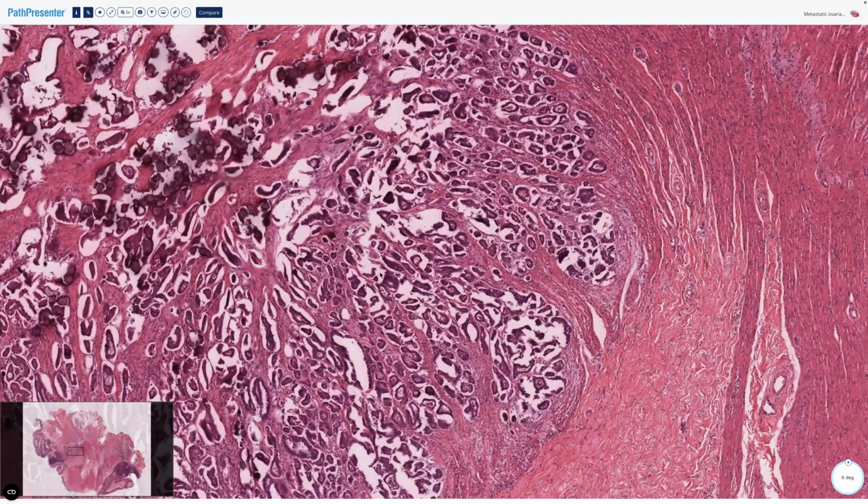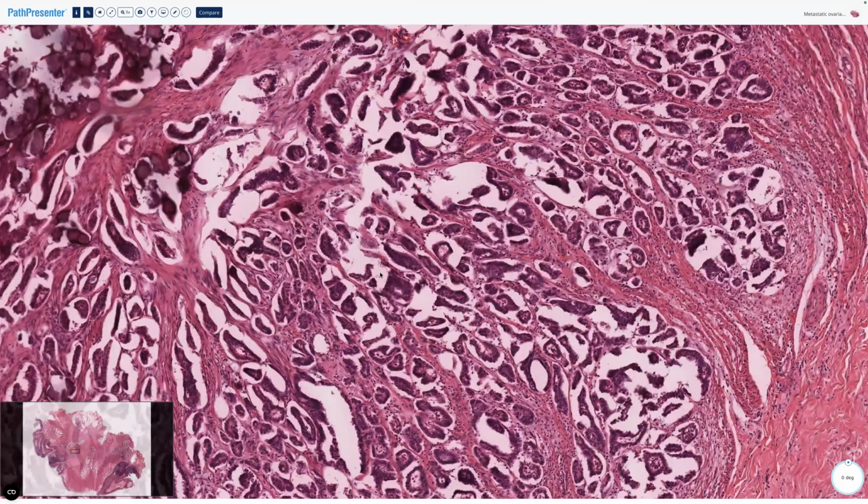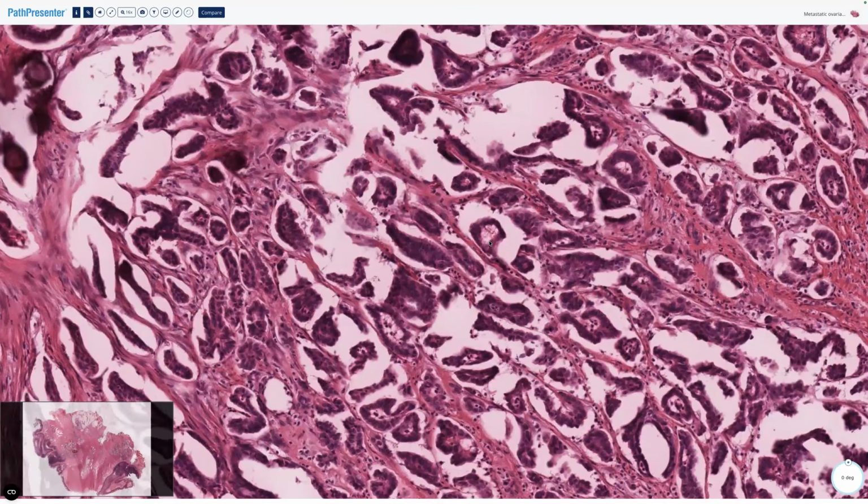So what do we mean by micropapillary? Well, it's a bit like a flipped inside out sock. If you think of a sock as an acinus, and then you put your fist in it and push it up, it flips everything inside out. So now we've got a vessel in the center and the epithelium on the outside.